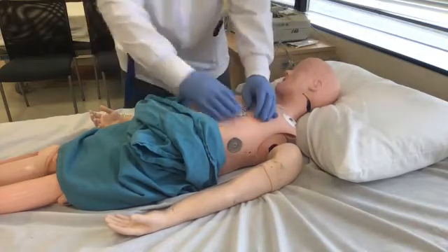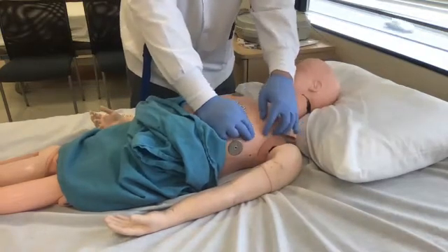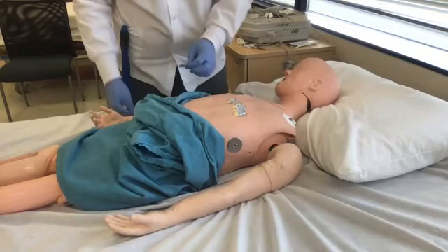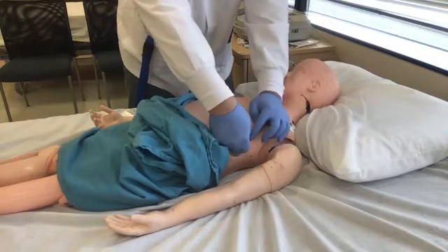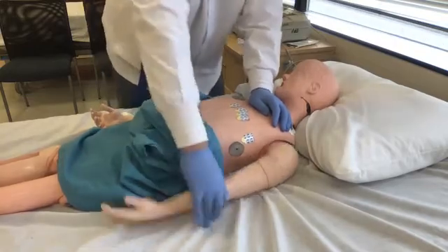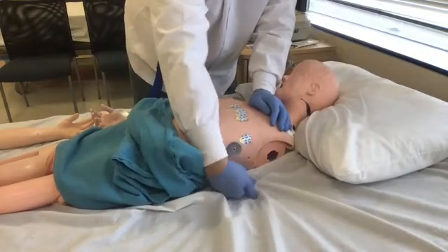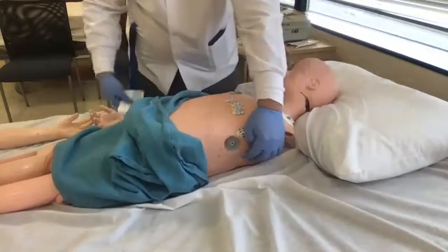Then you have fifth intercostal space. So I know this is 5. I'm feeling the space, feeling the space. Then I go to the anterior axillary line, right where the crease of my armpit is. So I'm following that contour. V1, 2, 3, 4. This is V5, fifth intercostal space, anterior axillary line. Now, where's your mid-axillary line? Let me remove his arm so you can see. Now, your mid-axillary line is in between what? The bottom of the bed and the top of his chest. So it's got to be where? Here. And again, fifth intercostal space.